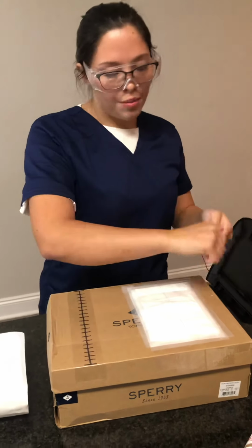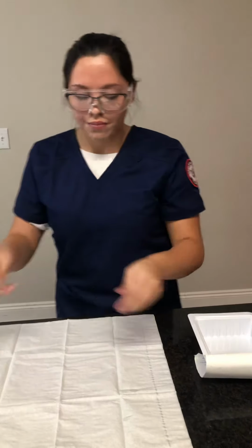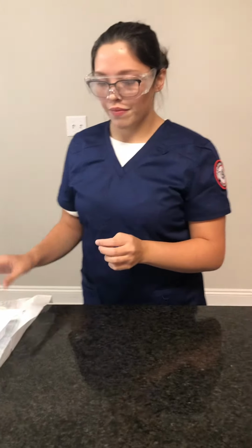I will then cover my patient back up, lower the bed, and raise the side rail. I will then perform hand hygiene and dispose of my sterile field. I will then go to the nurse's station and document points on the wound, the suture line, and how the patient tolerated the procedure.